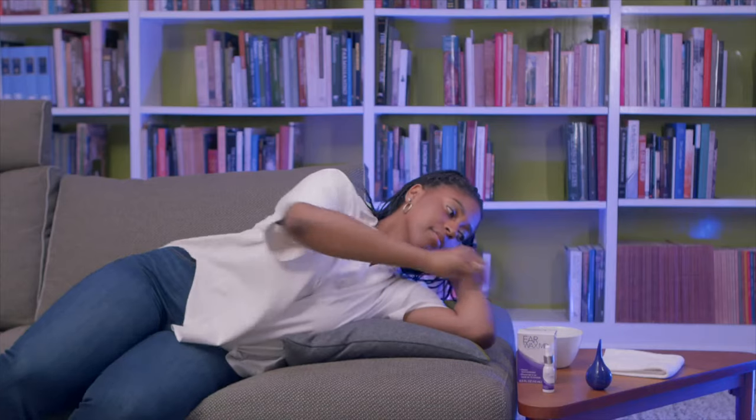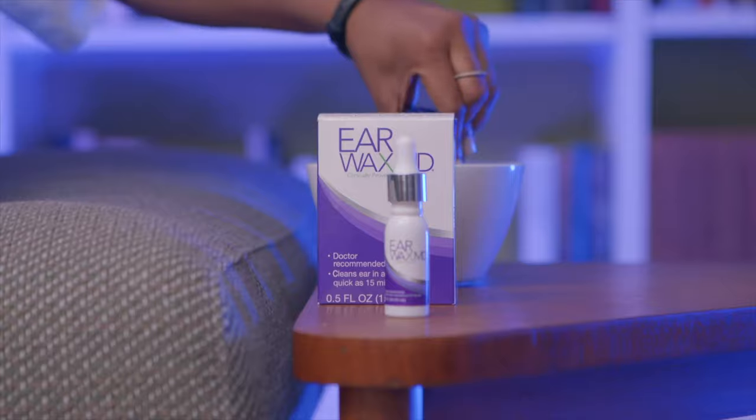To use Earwax MD, all you have to do is lay down on your side, fill your ear canal with the Earwax MD solution using a dropper, wait 15 minutes, and then flush out your ear canal with warm water over the sink or in the shower using a bulb syringe that comes with the Eocera Earwax MD Removal Kit. For really stubborn cases of earwax, repeat this process a second time.